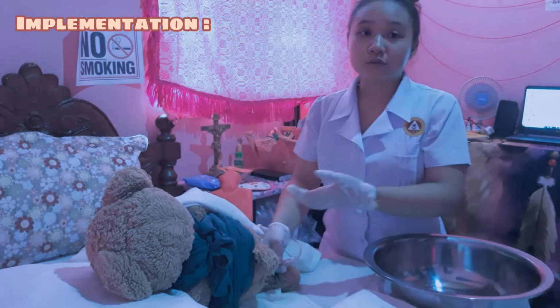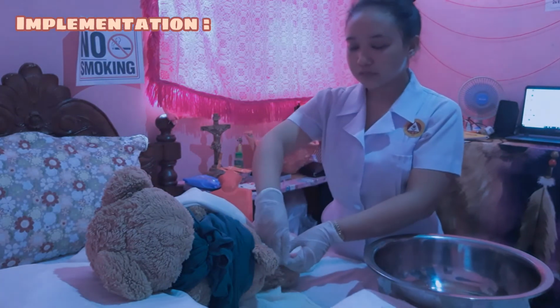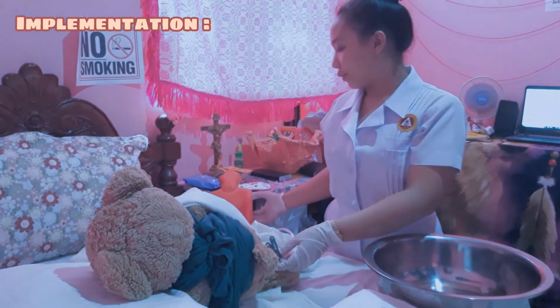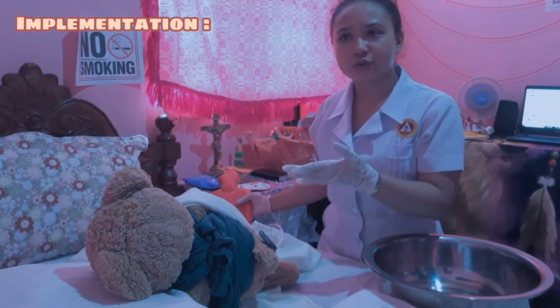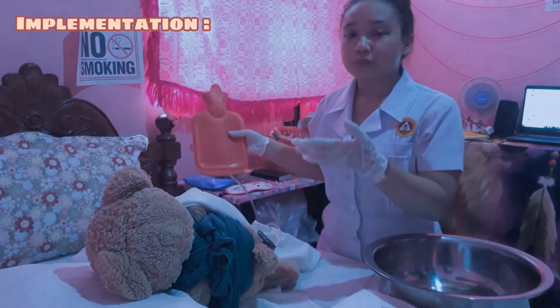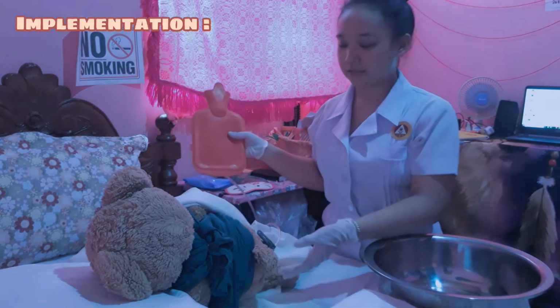Then you need to slowly administer the enema solution. Raise the solution container with the clamp open, and then open the clamp to allow the fluid to flow, or compress a pliable container by hand.